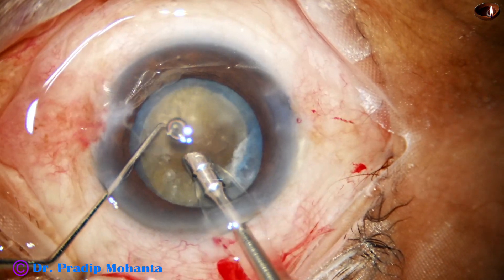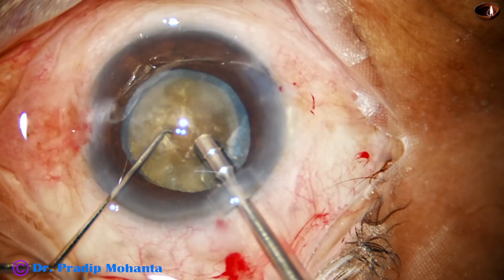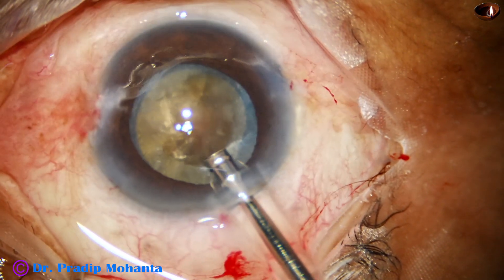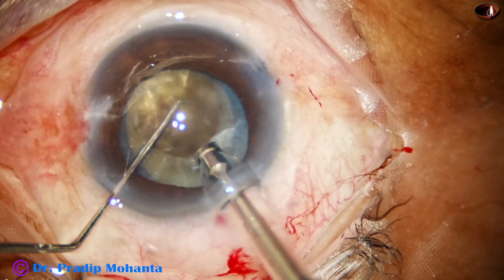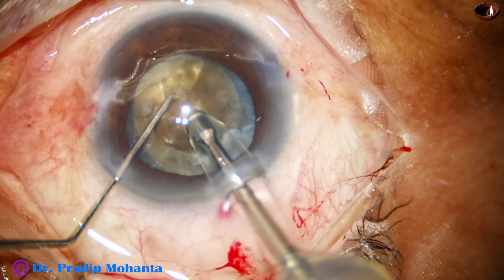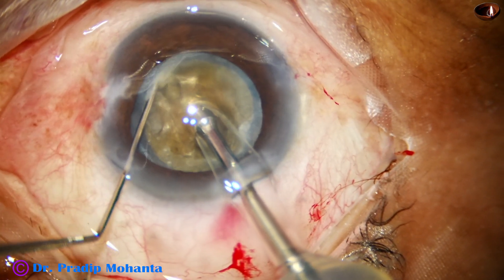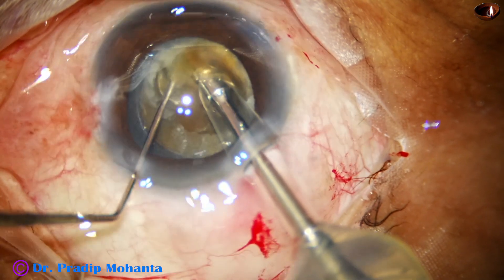Now I use the FACO needle to sculpt the very superficial epinuclear layer. Then I try my technique — the submarine chop technique. Here the FACO tip goes through the substance of the nucleus towards the opposite equator. As it reaches near the opposite equator, the chopper is used to get a crack.